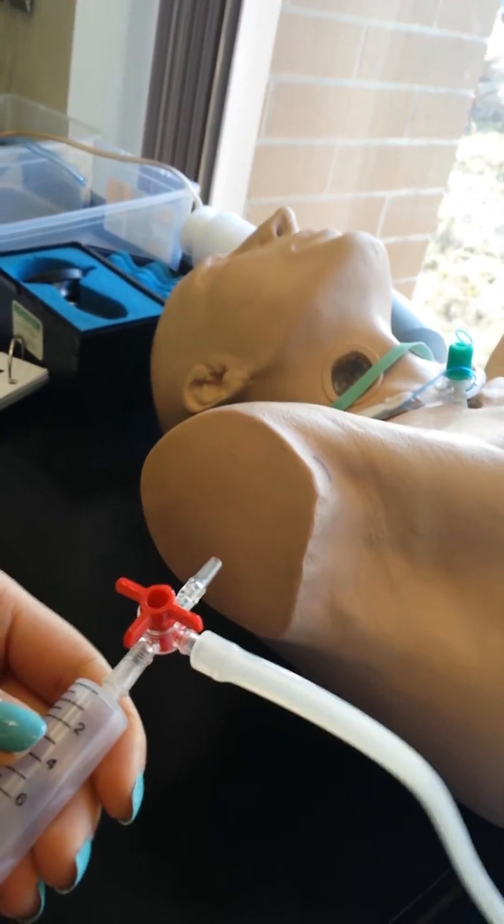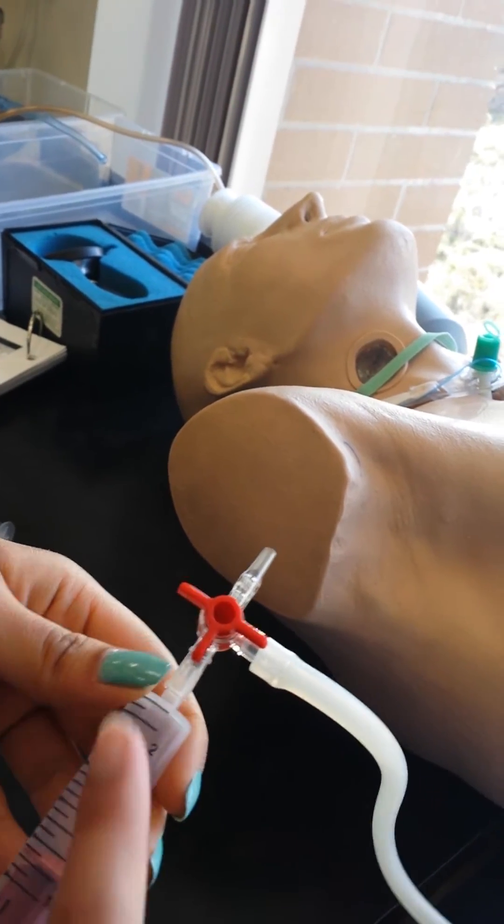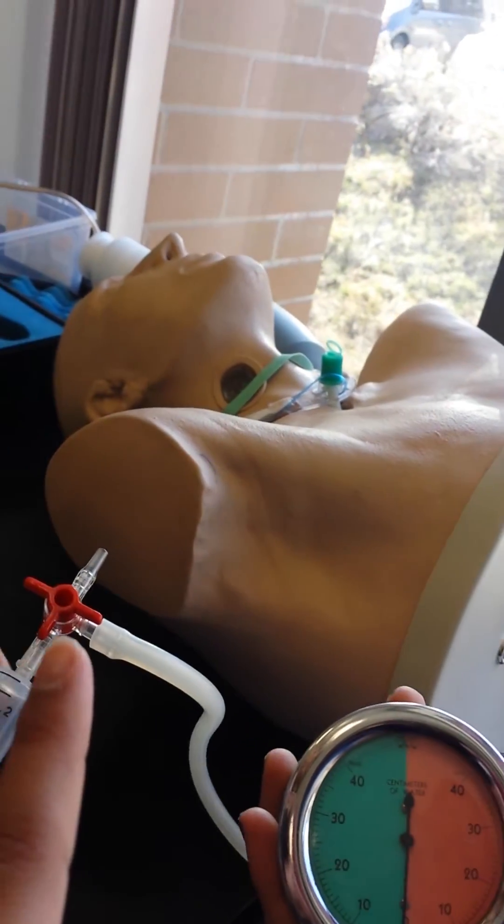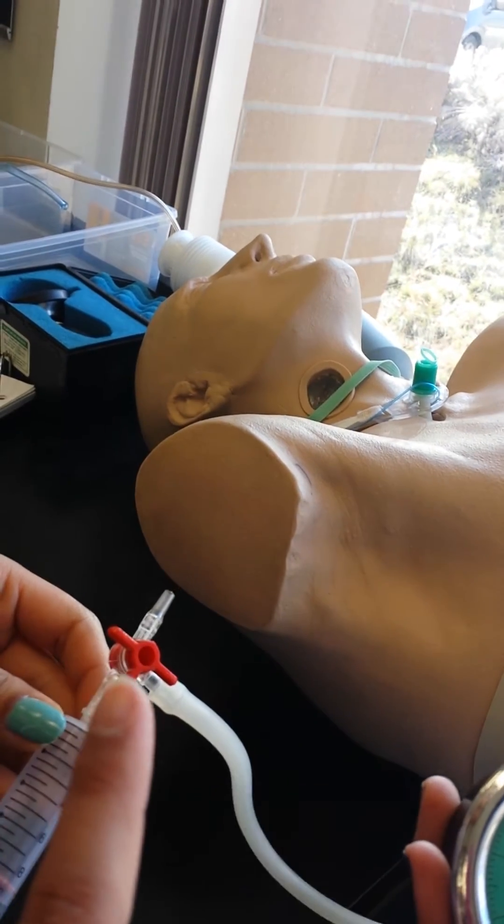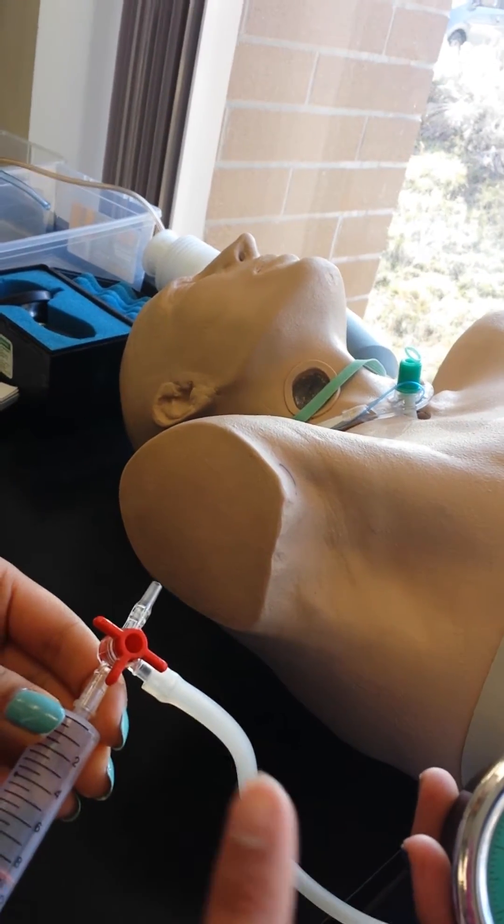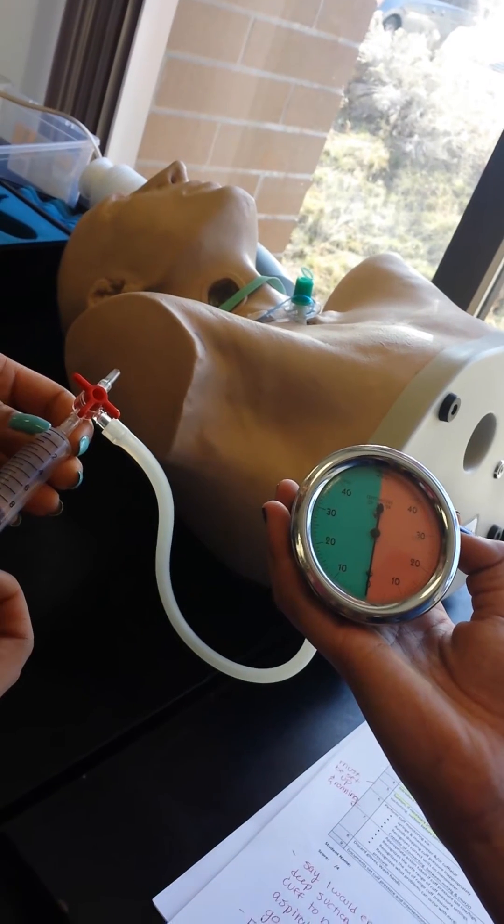You want it to go into the line all the way here because this is the line you're going to be connecting to the patient. So you have to make sure that one is pointing to the syringe and one is pointing that way. Now she's going to start adding pressure into 20.